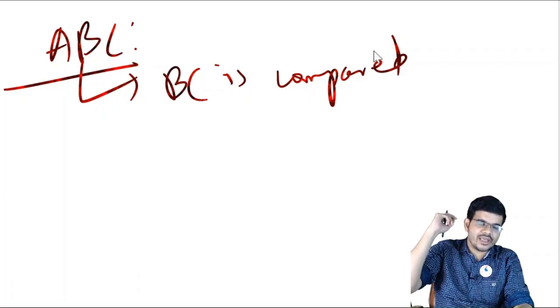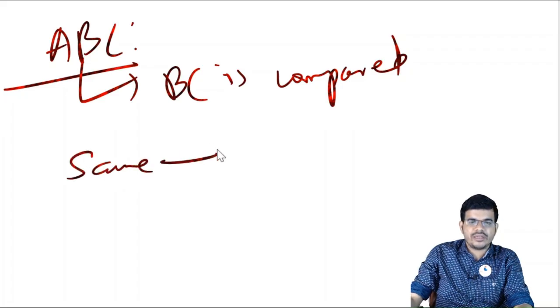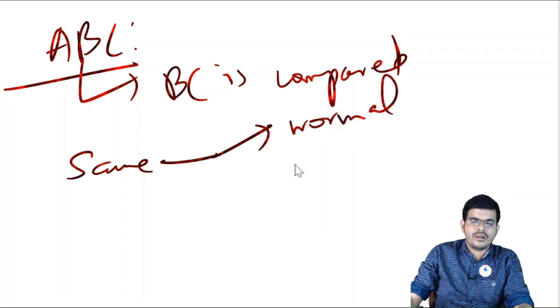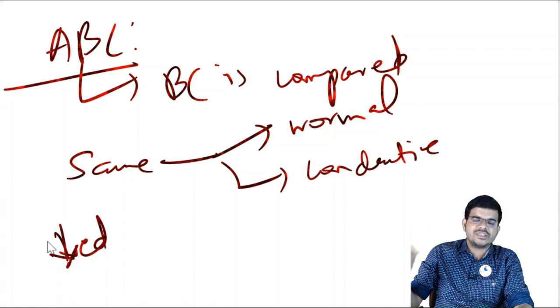When he stops hearing, the fork is kept over the examiner's mastoid after occluding his ear canal, and if the examiner is unable to hear, that means the absolute bone conduction is the same as that of the examiner, and it can have two conclusions. Either it can be normal hearing, or the patient may be having a conductive deafness, okay, or the absolute bone conduction can be reduced, that is, even after keeping it over the examiner's mastoid he is able to hear.